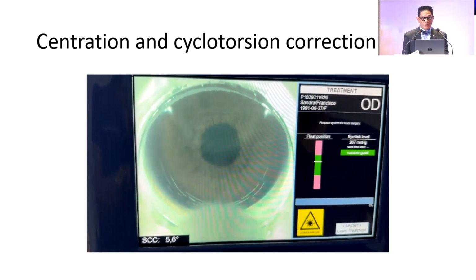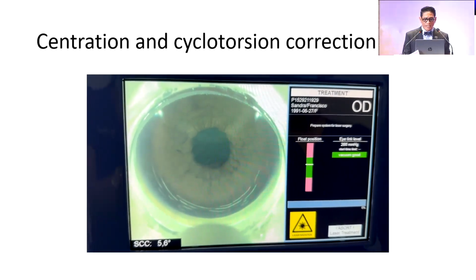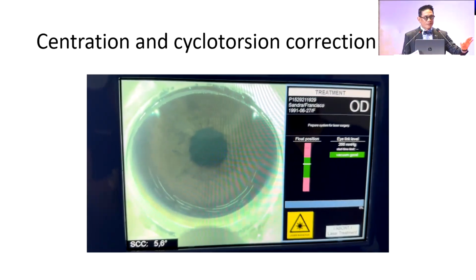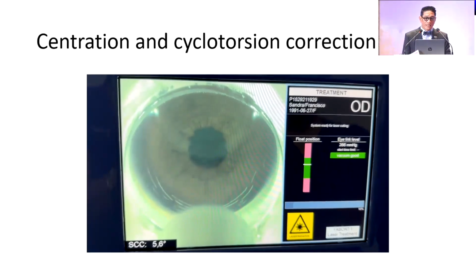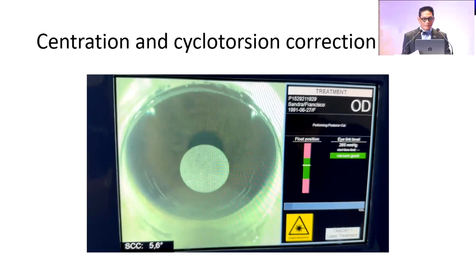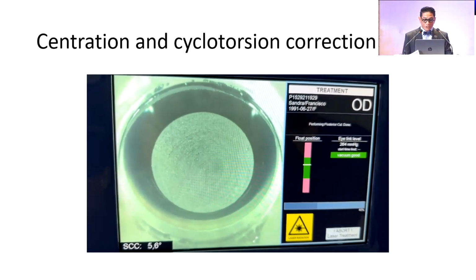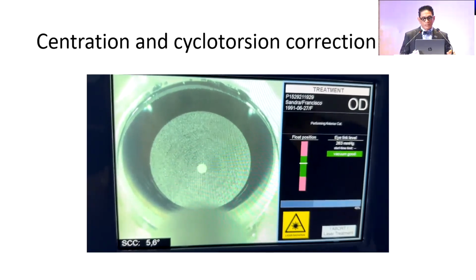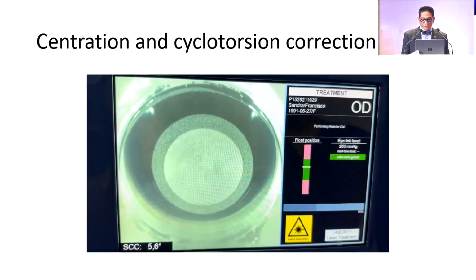I'll show you the probe later. That's the probe that you saw in the patient interface. It's going to shake, and once it shakes, that means it's already going to laser. This is the posterior laser first, and then we'll start the anterior. I usually make a 135-degree incision because I'm right-handed, so it's easier for me to dissect the lenticule after the laser.